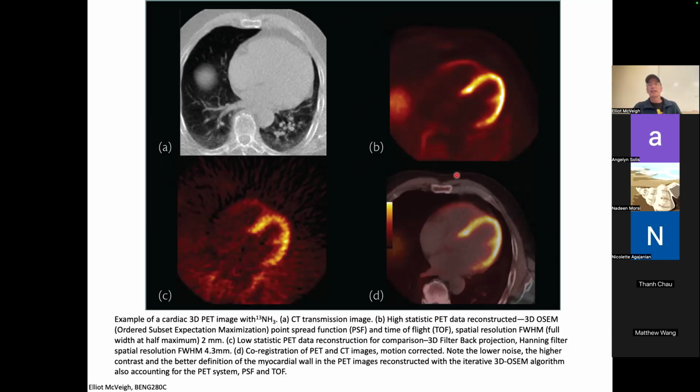And then once you've done that, you can essentially fit through noisy data that has this high frequency scatter on it. And you get a blurrier picture, no question, right? But it's a probability estimate for what is the intensity at each point. It's like the maximum likelihood of that pixel being true given the noise model and given the model for how the scanner works.